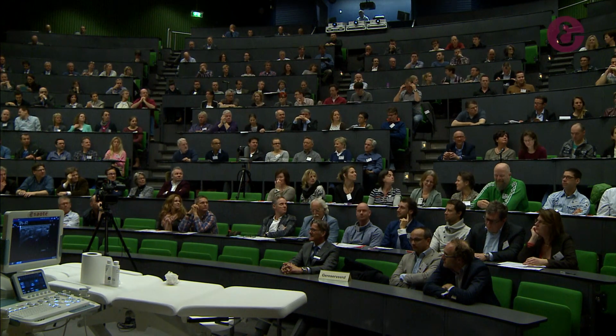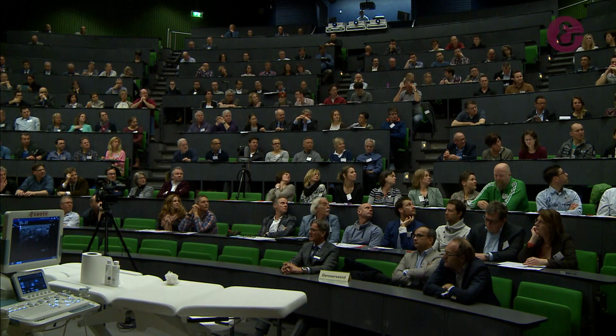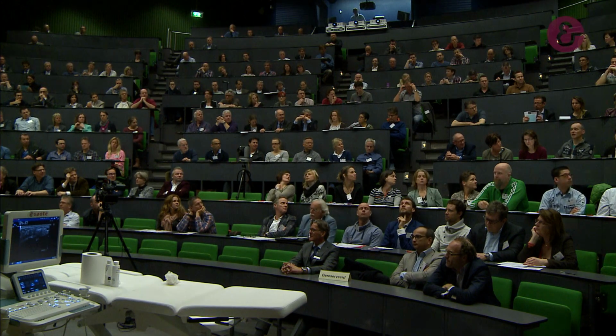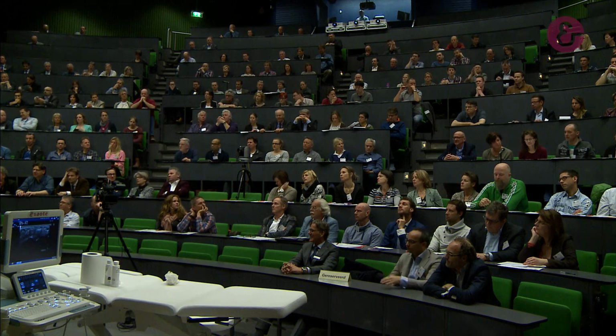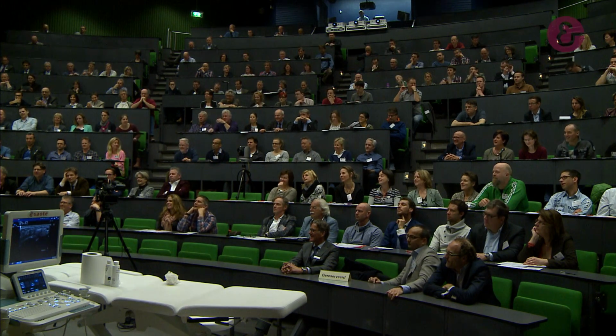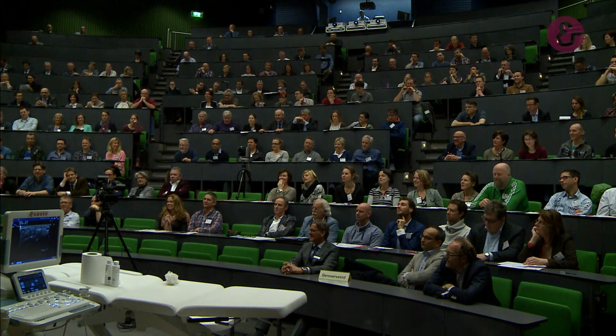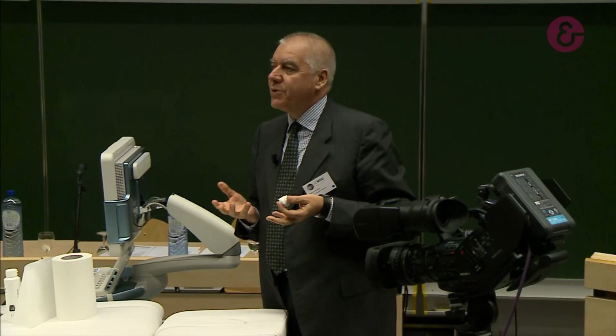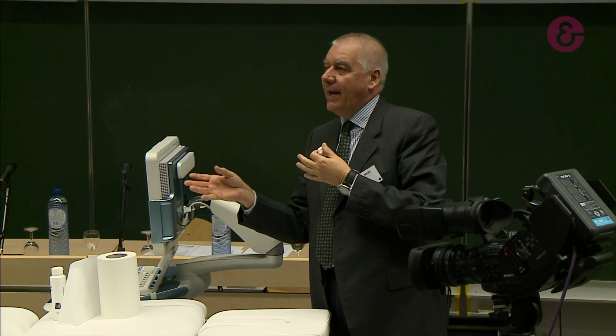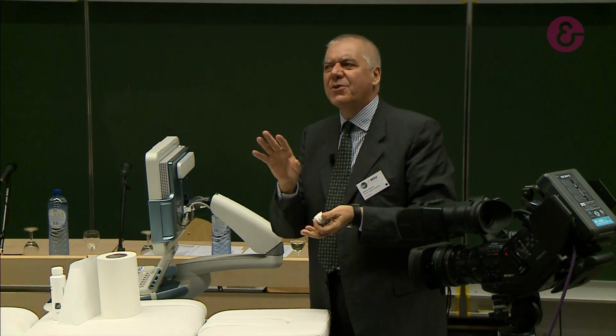Yeah. So there is no normal variety in thickness of nerve. Every thickness. You know, I am from Italy. This is the answer. I know, I understand well. But what I do usually, I take the shortcut. I look to the other side, but it's not so frequent.